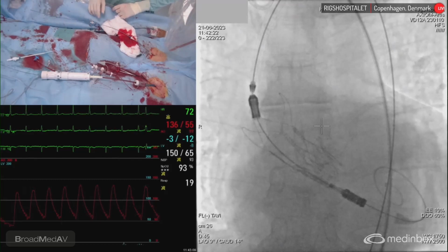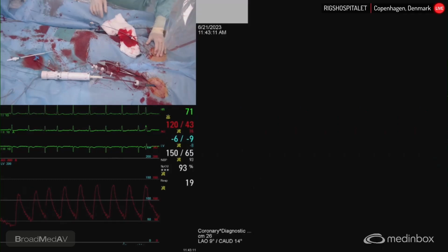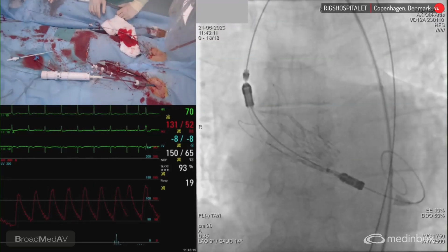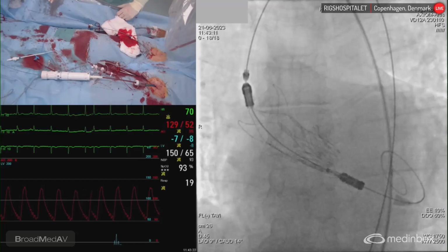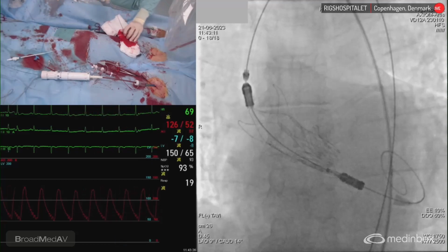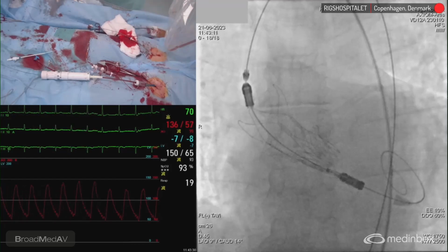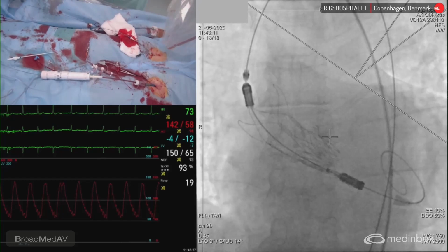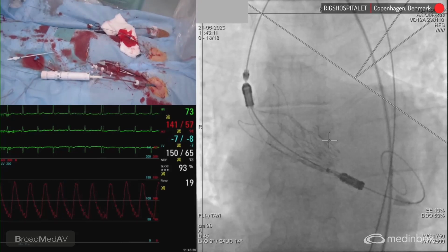Give me one more Prostyle, maybe. I do otherwise one like. I mean, he's very stable, yes. So we can take our time here. It's better we do it proper. Just give me an extra additional puncture. I'm gonna make an additional puncture. Can we do that? So let's remove maybe this one. Well, let's not remove anything now. Needle for the puncture. And a wire, small wire.